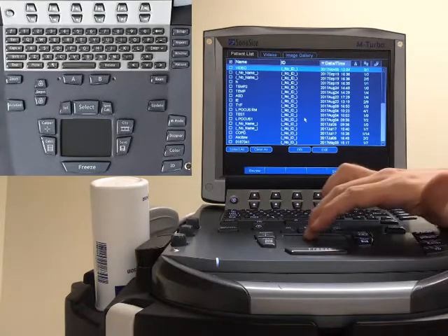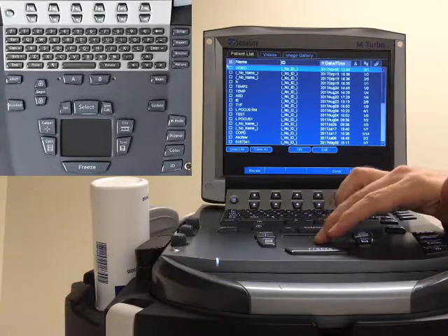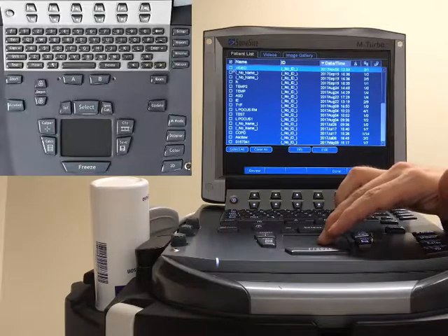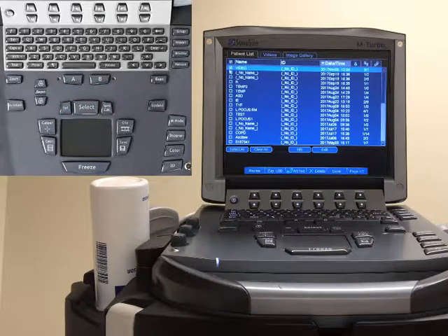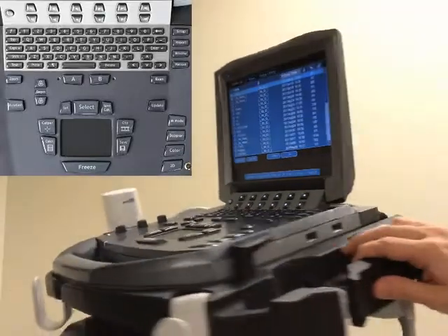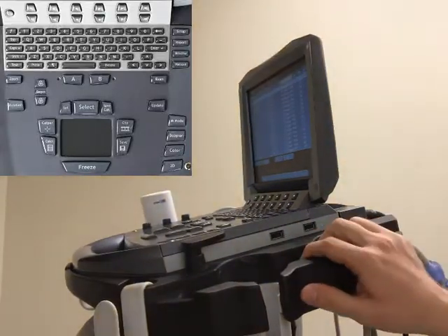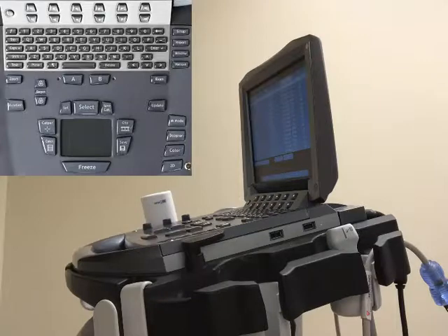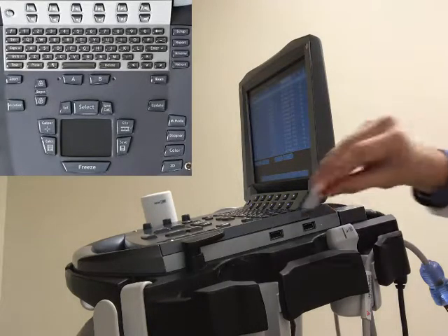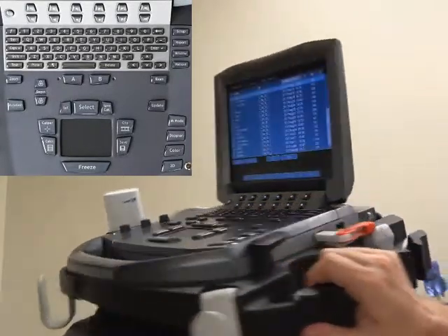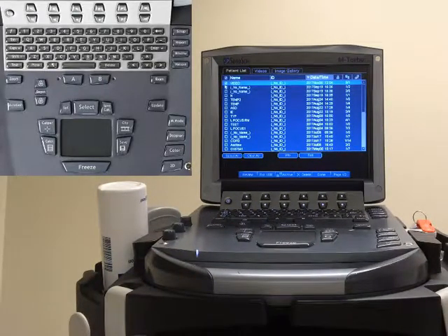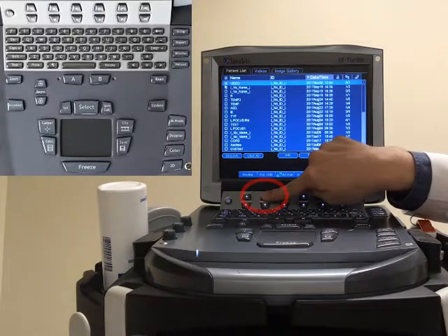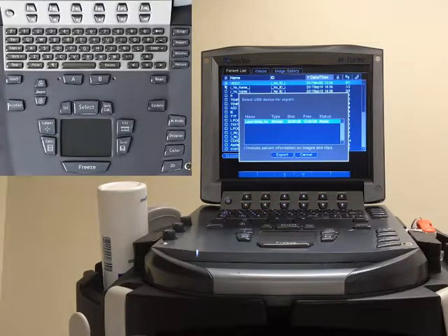With the trackpad or the arrow keys, simply move over the image you want to export and push select. On this machine the USB ports are located on the right-hand side, so simply insert your USB key. With the study selected, press export to USB — it indicates the storage that you have inserted.